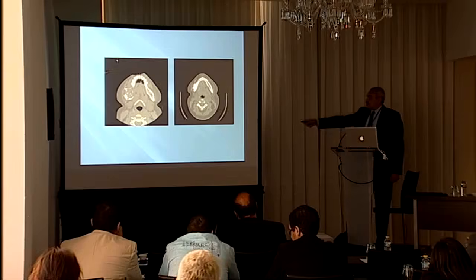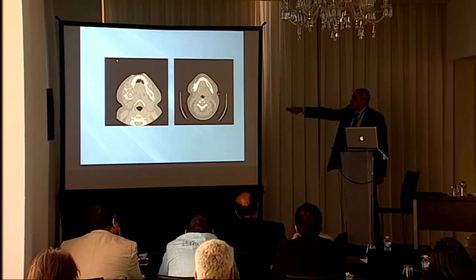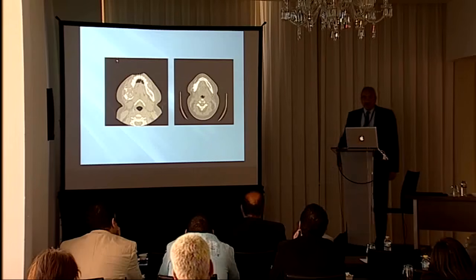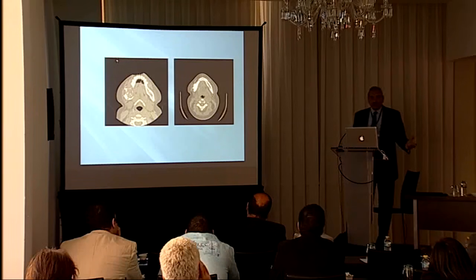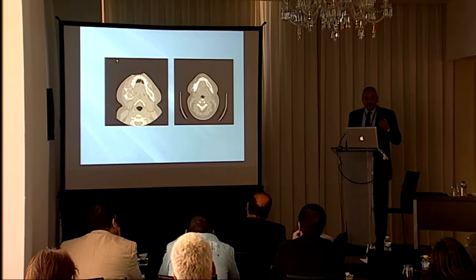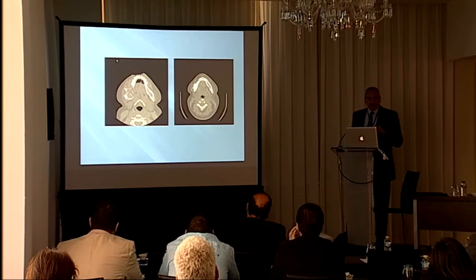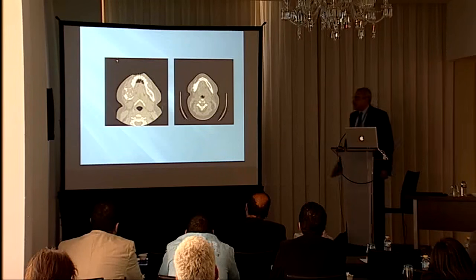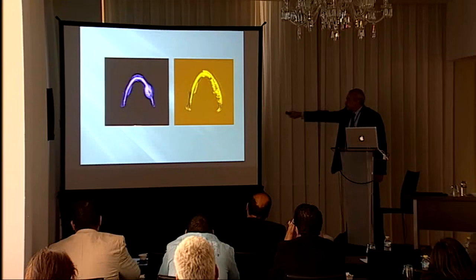But in the post-operative CT scans, you can see the mandibular symmetry. And I've done that for years and years. I'm an old guy, without the use of computer guidance. And now with the use of computer guidance, when I look back even at my cases that I was proud of, I can see differences I can now avoid, and I can give the patient the exact symmetry. And you can see here, this is the mandible, and this is the reconstruction plate.